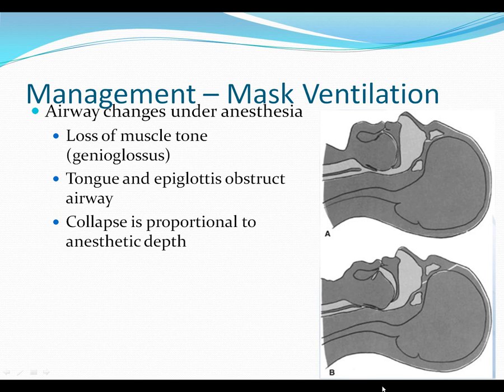And believe it or not, things that we do, it'll get to the point of becoming intuitive, like you'll see, but what we are very good at is relieving this upper airway obstruction. So all those things that you guys have been doing, so putting in nasal airway, oral airway, jaw thrust, chin lift, sniffing position. Really the whole point of that, for the most part, is to just open up this obstruction that happens every time we anesthetize people.